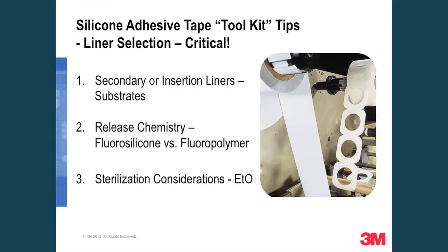But the fluoropolymers and the fluorosilicone polymers, you shouldn't be looking at gamma sterilization. Gamma sterilization can cause those to cross-link, and then the liner won't come off. So remember that in the long run, you might want to consider only using ETO-type sterilization. The ethylene oxide gas allows for good sterilization without the cross-linking that the gamma and the E-beam can cause. It's possible that you could use steam sterilization, but we really haven't considered that, and in general, most of the applications that we're looking at probably wouldn't be steam sterilized to begin with. So ETO.